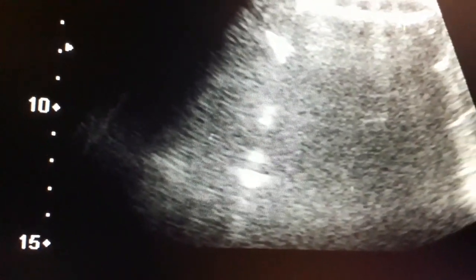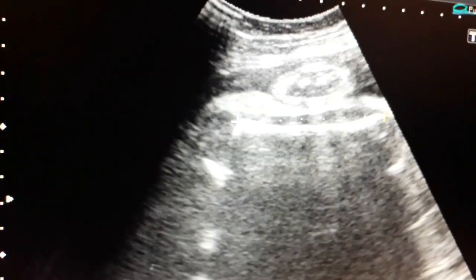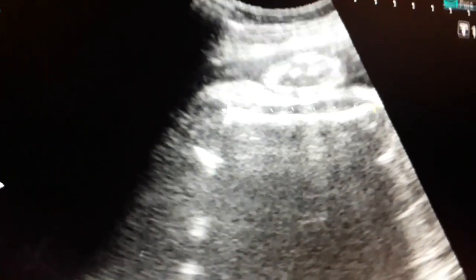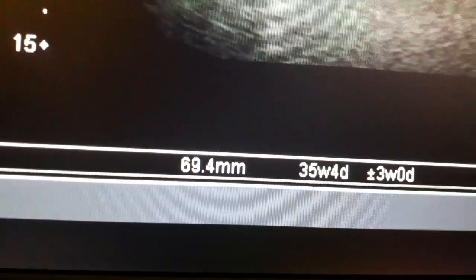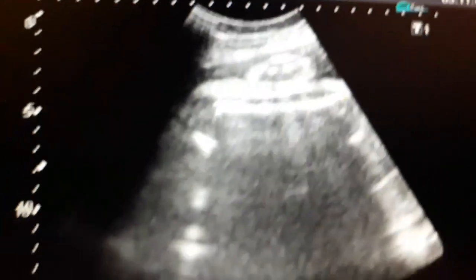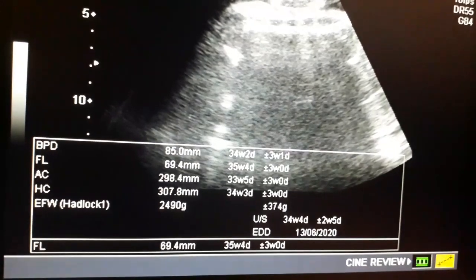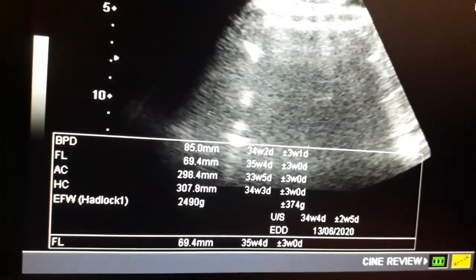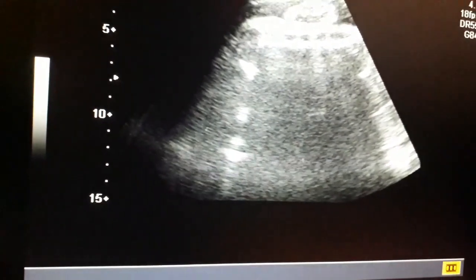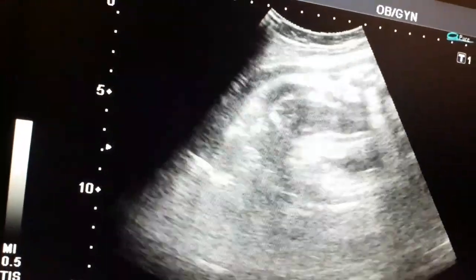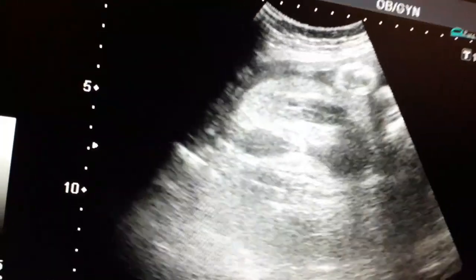Now I will measure the femur length from the greater trochanter to the lower end of the femur. In advanced pregnancy, femur length is more important. It measures about 35 on ultrasound, with a plus or minus of two to three weeks, indicating a gestational age of approximately 34 to 35 weeks.